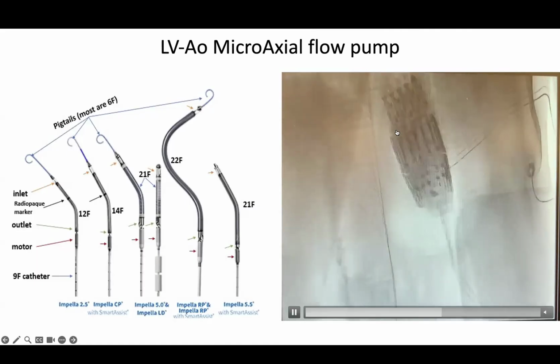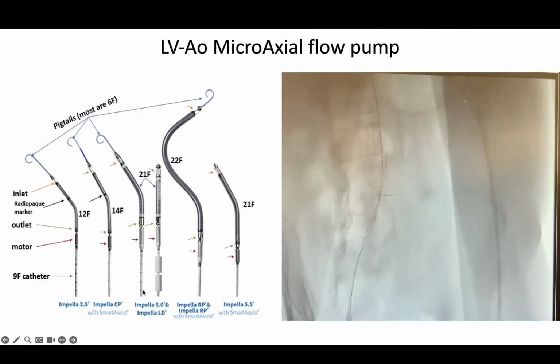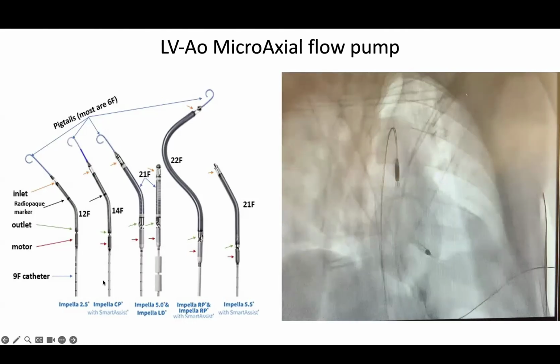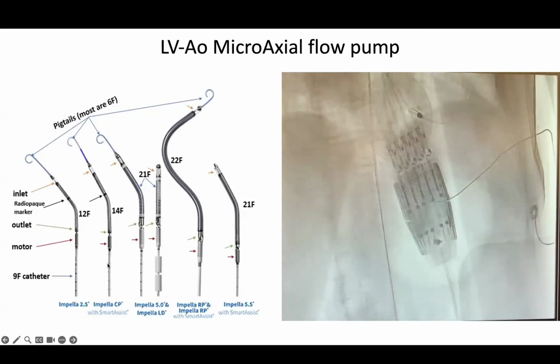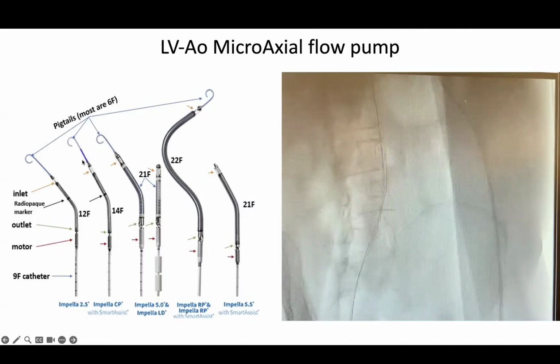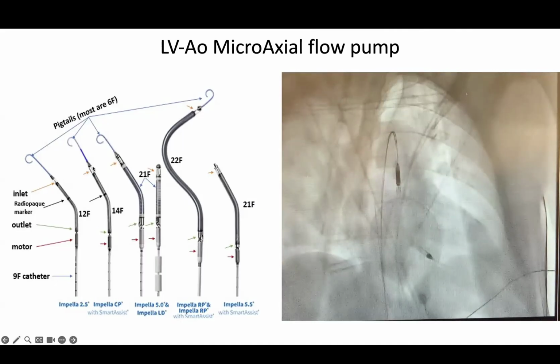For our lab, you'll be seeing the Impella CP, right? And the 5.5s in our ICUs. So the Impella CP, as you know, is a 14 French sheath. It's a 9 French drive line, and has an inflow cannula and an outflow cannula and a sensor distally that helps you with waveforms and whatnot.